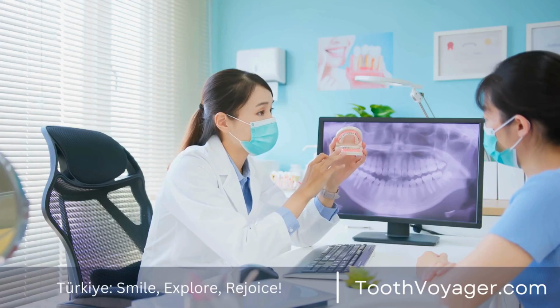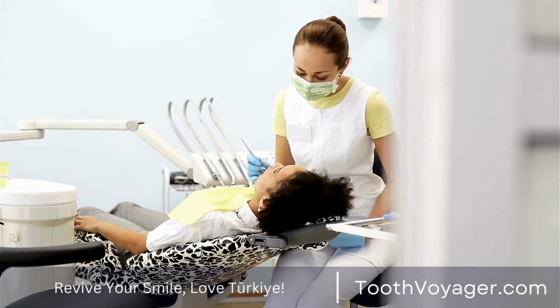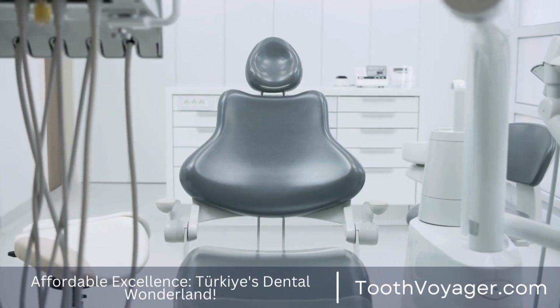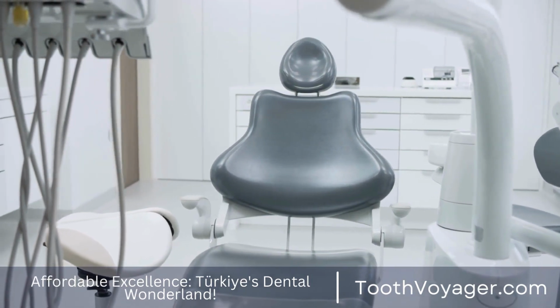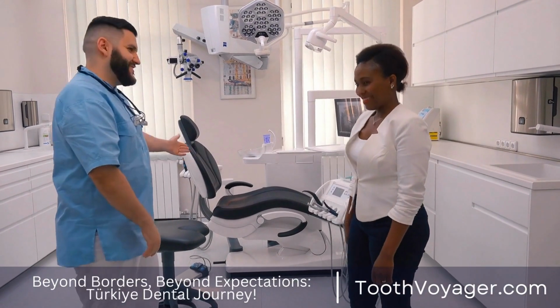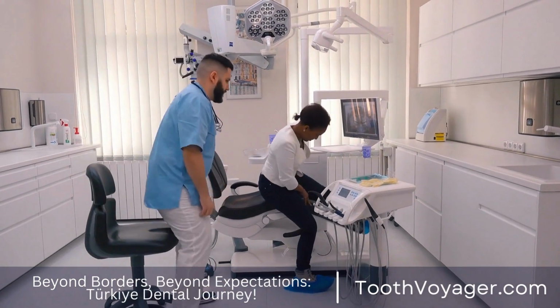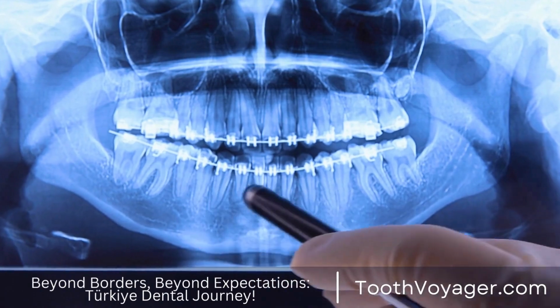What are dental prosthetics? Prosthetic teeth are made of plastic, which are made specifically to fit an individual's mouth and are matched to their appearance to natural teeth. There are many kinds of dental prosthetics, comprising dentures, dental implants, crowns, and bridges, and they are developed by dental professionals in a dental lab, with the use of advanced technology and materials for ensuring an exact shape and natural appearance.